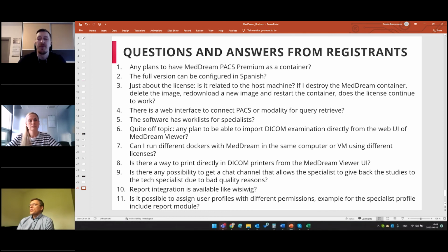And also, as you, Marius, explained before, it's also very important if you highly use our Dockers and you would like deeper integration, more deeply automated processes. You also need to communicate with our team, maybe to create dedicated Dockers with dedicated workflows. This also would be a solution for these very intensive integration cases. Okay, I can go to the next question, yes?